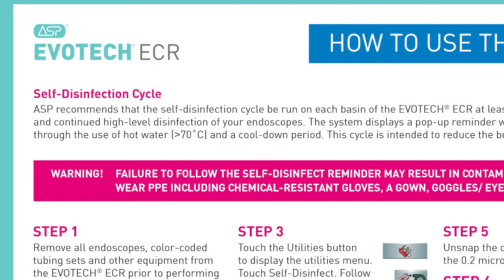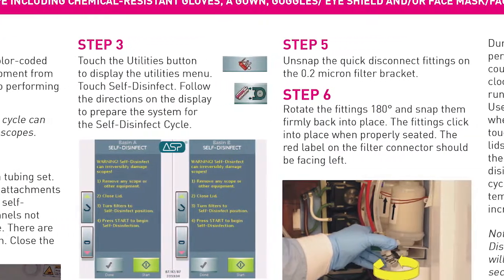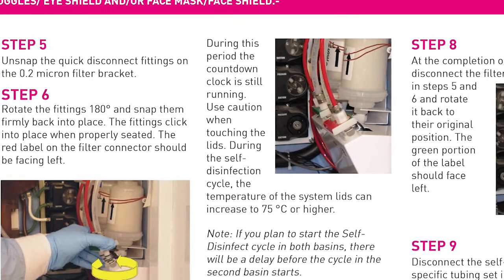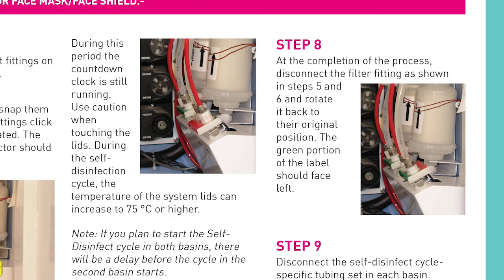Follow the provided self-disinfect poster for step-by-step instructions. Failure to follow the self-disinfect reminders may result in contamination or bacterial growth and lead to an inadequate disinfection of subsequent loads. PPE is required for this process, and both basins must be empty to run a self-disinfect.